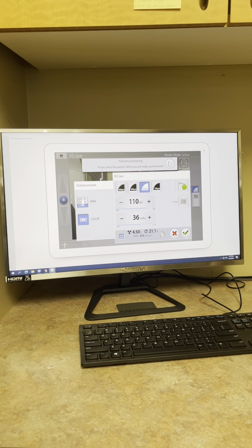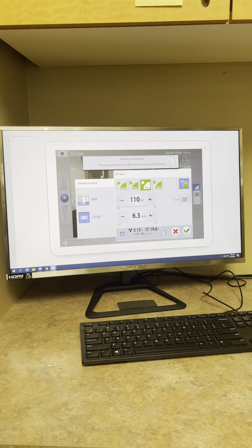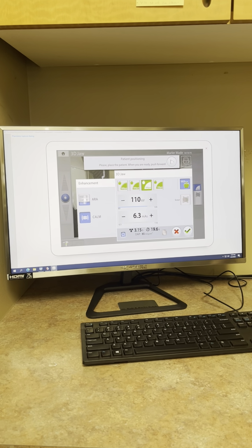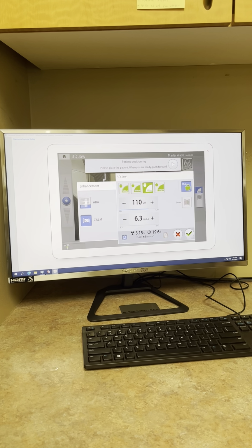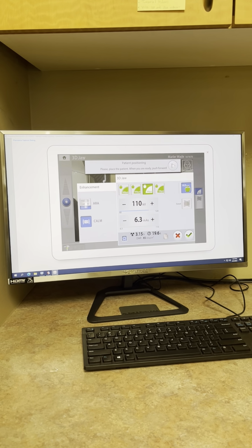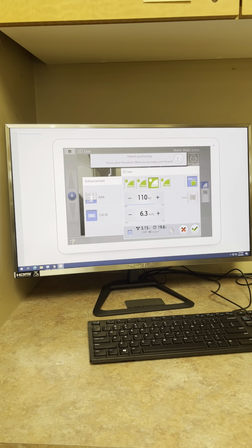So the reality is that when you use ULD, you're drastically reducing x-ray exposure to the patient, but you guys aren't getting a sacrifice in image quality. And you're like, how can that be? That's magic, right? Does it take longer? No. What happens when you use ULD is we're lowering the milliamperes out of the tube head. Every company does it. We all lower the MA to get lower dose. You speed up the scan time, so it's scanning a little quicker.